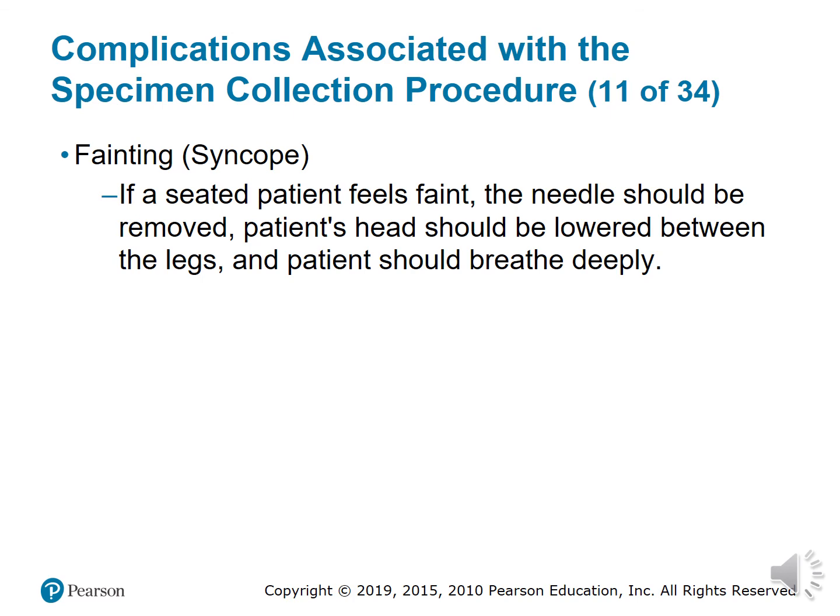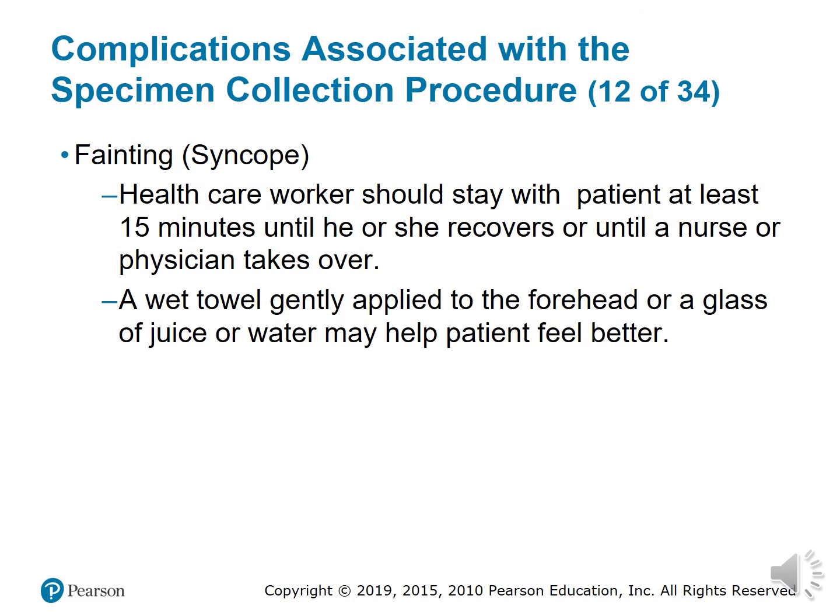If the patient feels faint, the needle should be removed. The patient's head should be lowered between the legs, and the patient should breathe deeply. The healthcare worker should stay with the patient at least 15 minutes until he or she recovers or until a nurse or physician takes over. A wet towel gently applied to the forehead or a glass of juice or water may help the patient feel better.